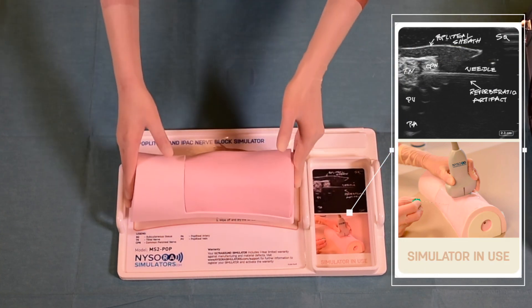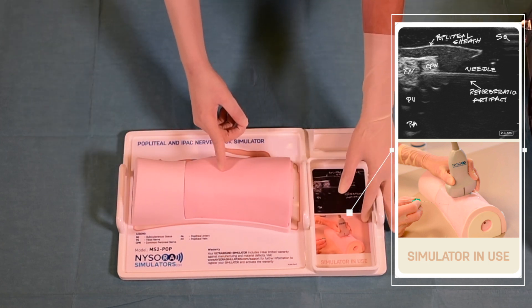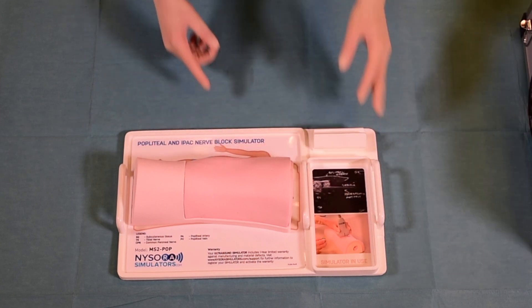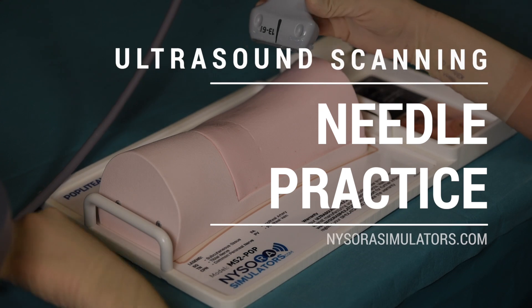To begin practicing, apply a generous amount of gel on the surface of the simulator. Before sonographing, it is important to increase the ultrasound gain because of the difference in the simulator material and real human tissue.